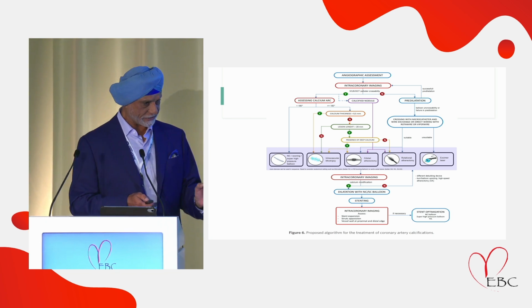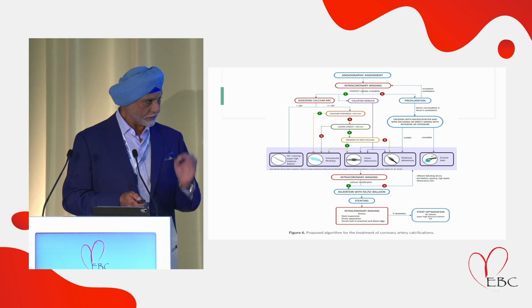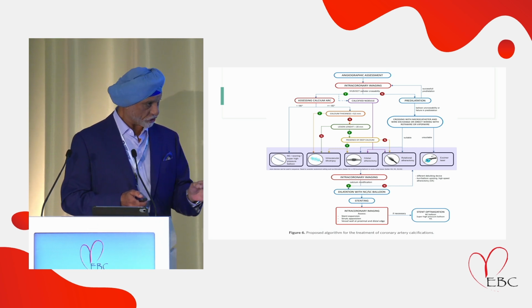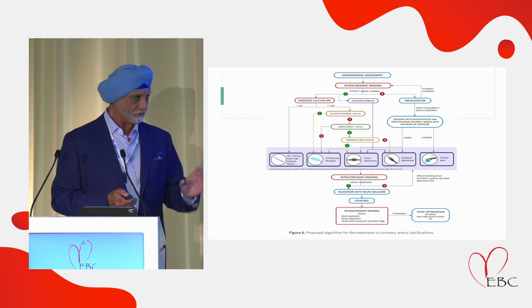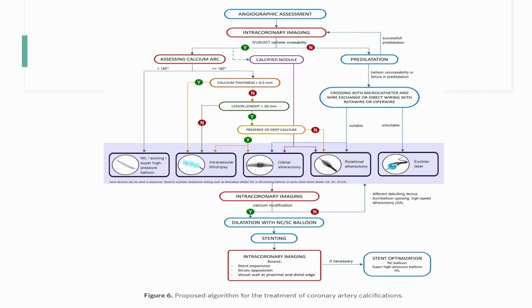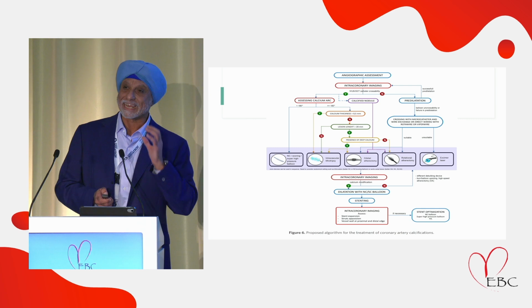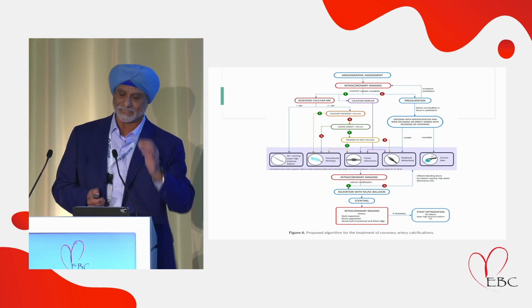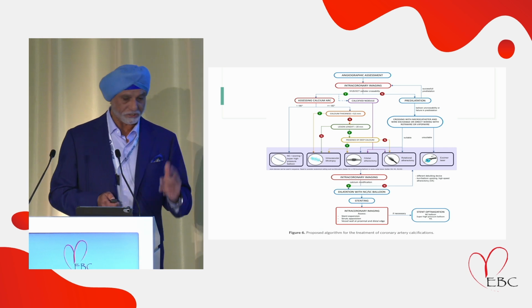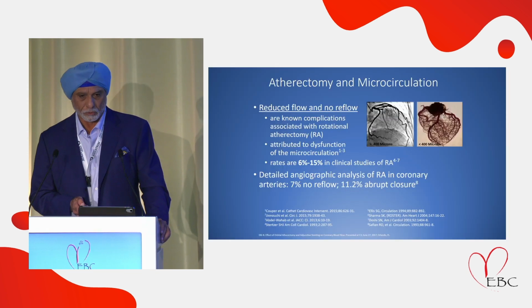You've got to reassess before you do definitive therapy, to reassess whether you fractured, either it's a dissection or you fractured the plaque or the nodule, or even with a balloon, to take two angles to see if your balloon has yielded or not. Otherwise, you're going to run into problems. Dr. Gwon showed this case of circumflex where it's eccentric. Eccentricity index in BVS was very important. In calcium, it's even more important, and that's what the data shows. So I think it's very important to understand, especially in nodules, that you've done a good job.